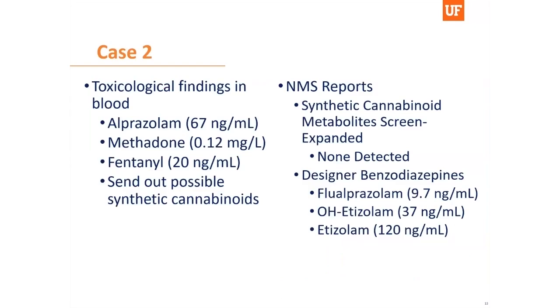Here is the recap of the results that we determined from our comprehensive drug screen on the left side of the screen. Since we already had sent out the blood for synthetic cannabinoids, we were able to add additional testing for the designer benzodiazepines. The NMS report for synthetic cannabinoids was negative.